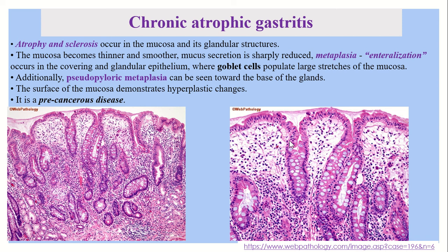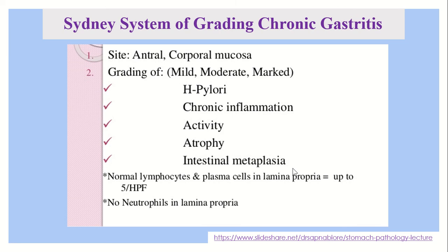Normally, you know, these cells are absent in the covering epithelium and the glandular epithelium of the mucosa. And you see here the mucous lining, as you know that the covering epithelial cells of the stomach also can produce the mucus that prevents the wall of the stomach from the acid environment of the lumen.